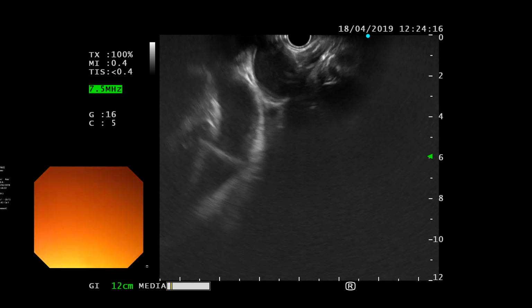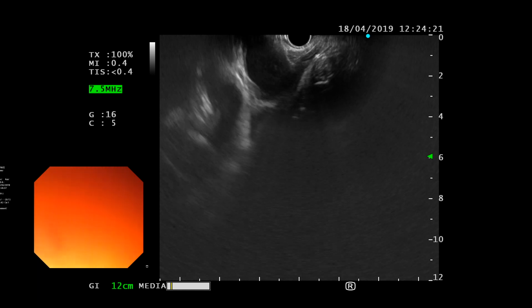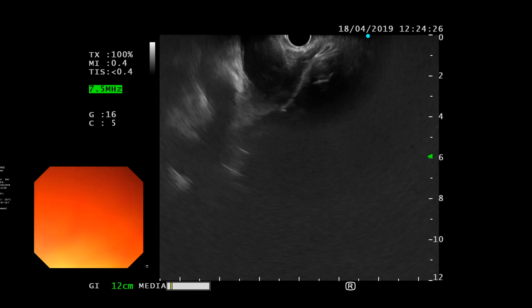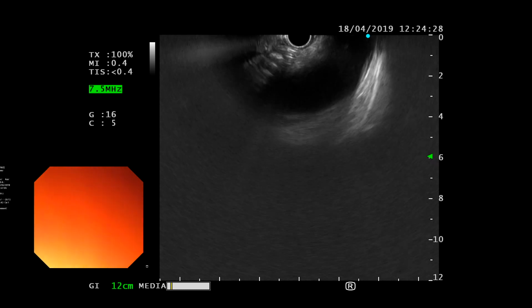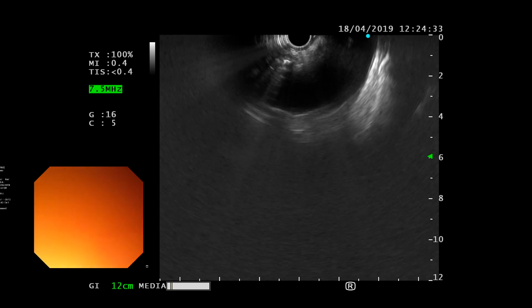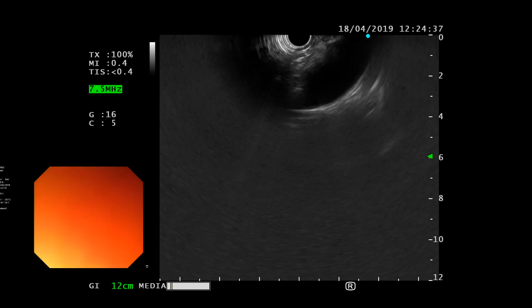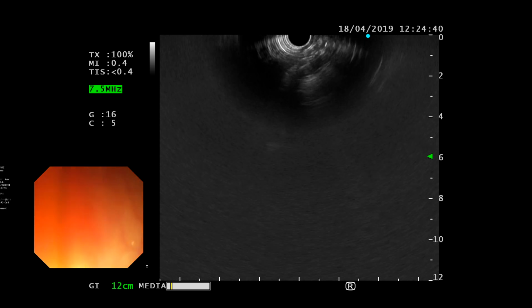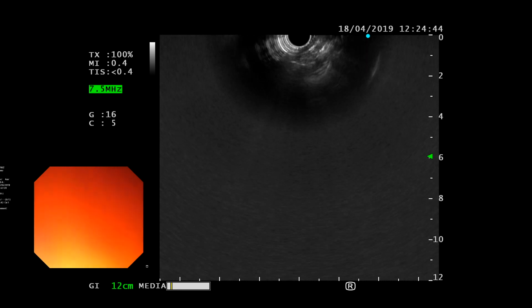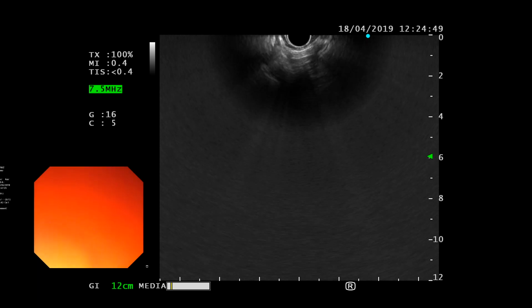And you then withdraw. Okay, that's it. You don't want to withdraw first, there is much bronchus, and then arch. So you already passed the arch though, so you want to just gently advance. Yeah, this is the arch. Now if you do thumb down, and just push, go clockwise, go clockwise a lot. Thumb down some more, towards you. Yeah, that's the trachea.